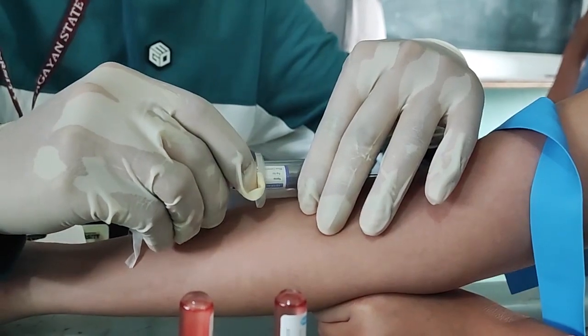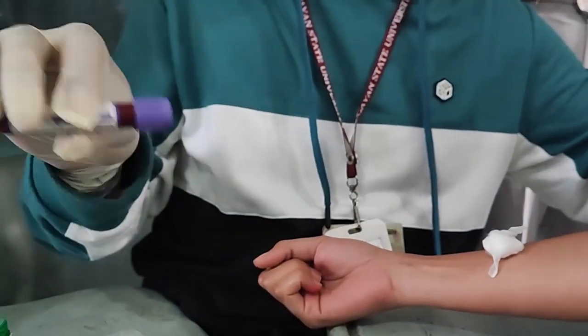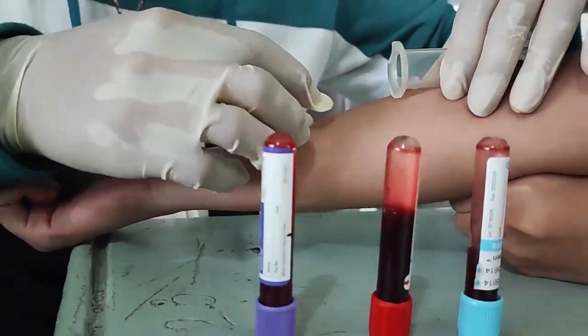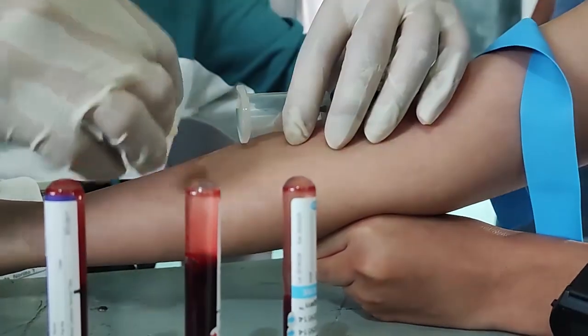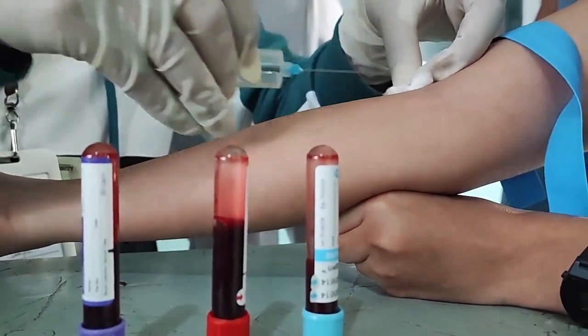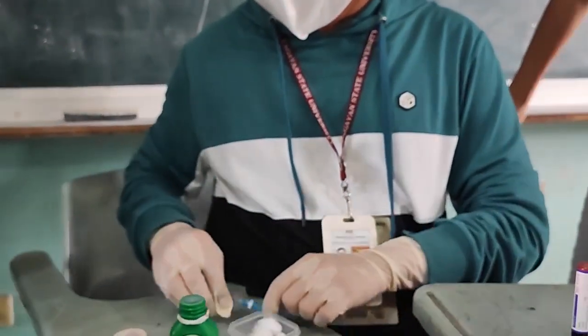Going to invert it for 8 times. 1, 2, 3, 4, 5, 6, 7, 8. And then, tatanggalin na po natin ito. So, that's the procedure po. Okay, very good, Mr. Norlito.